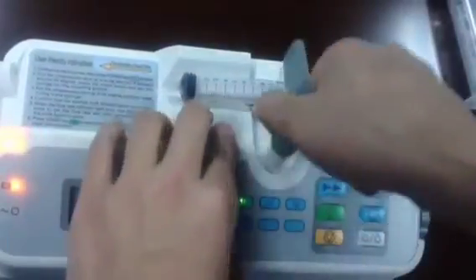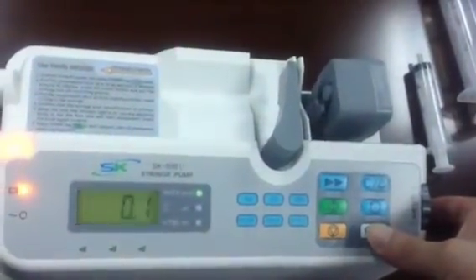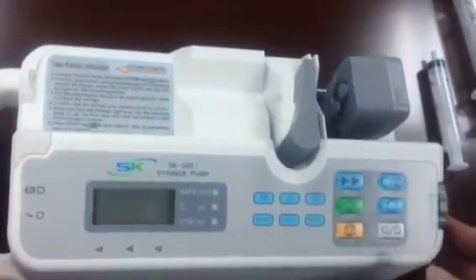Then remove the syringe and power off. That's all. Thank you.